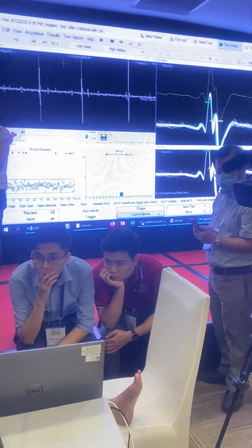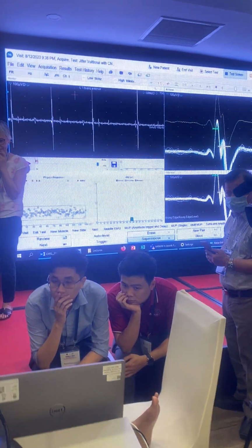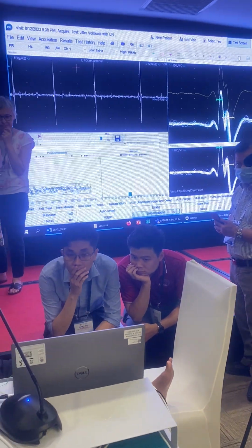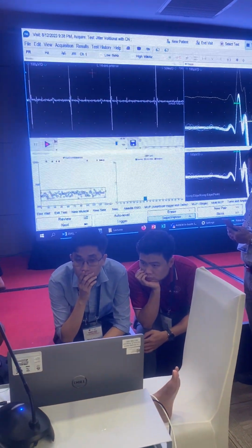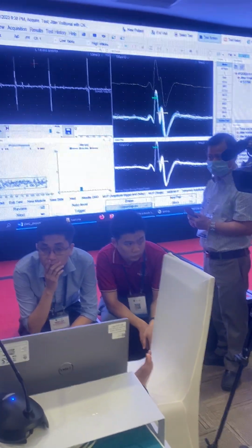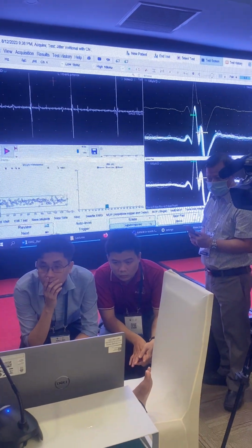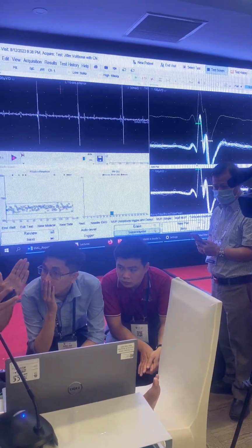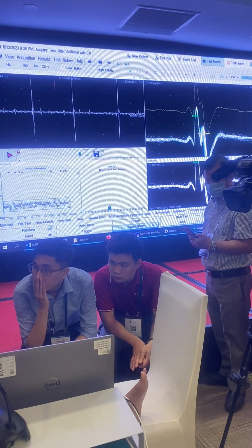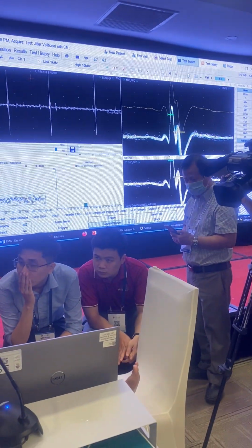See, this jitter is 51, this is normal, okay? Let me see if I use peak for analysis and it becomes 41. So when the potentials are very close to each other, you may want to use peak for analysis. When the potentials are away from each other, then you can use peak or you can use level trigger.